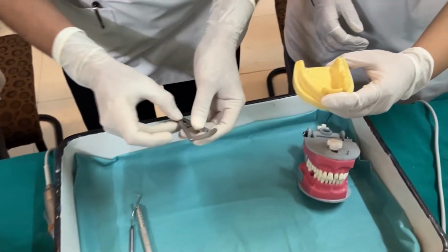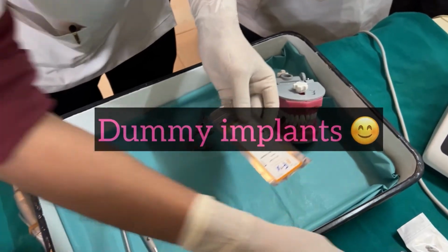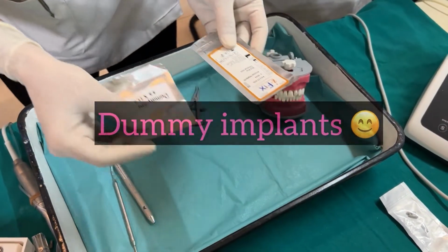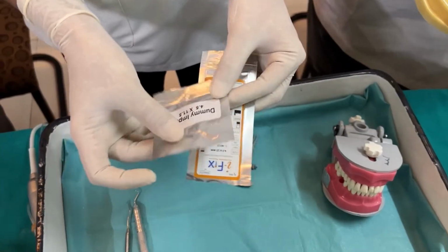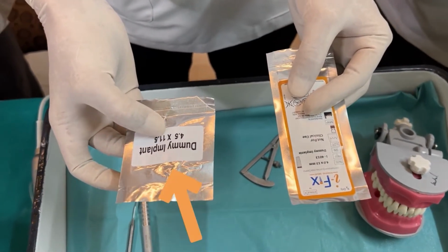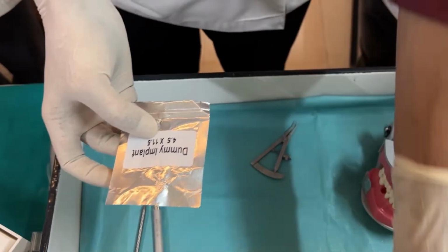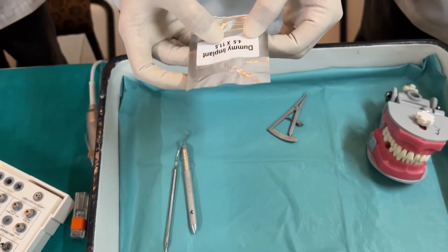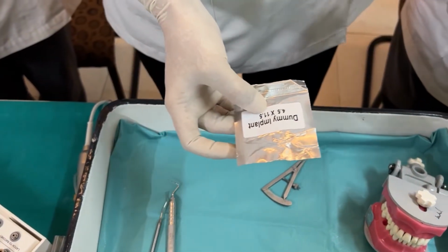So now the implant that we will be placing, these are the dummy implants that we have for this demonstration. In these dummy implants, we will be placing this particular implant, 4.5 into 11.5 millimeter. So in order to place an implant of 4.5, let's say a round figure of 5 millimeter diameter, how much should be the distance?